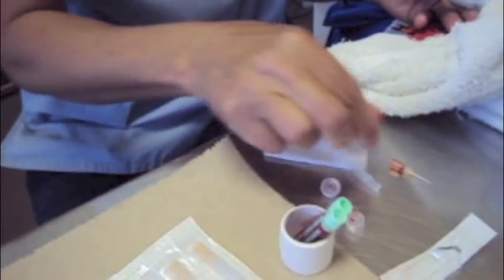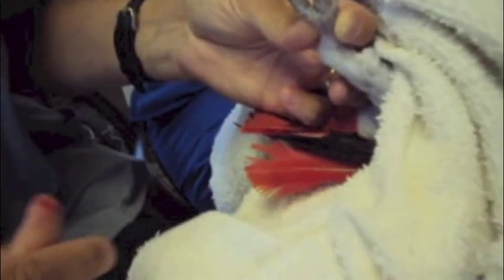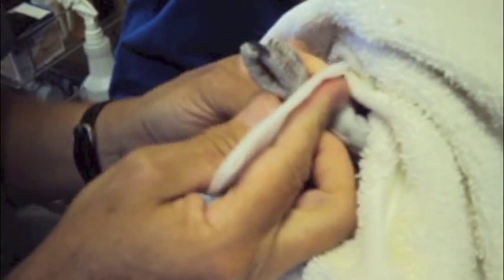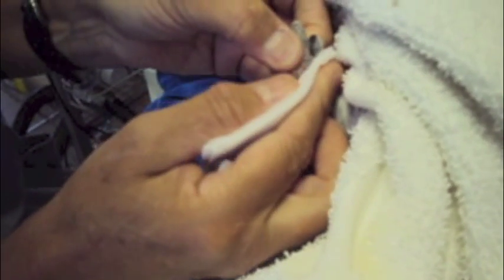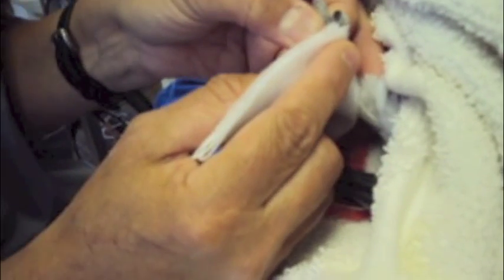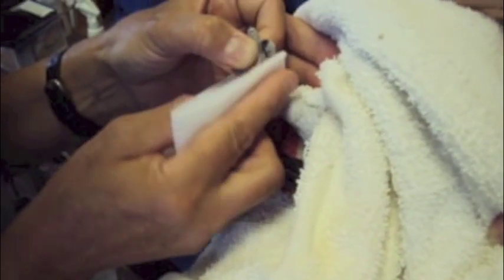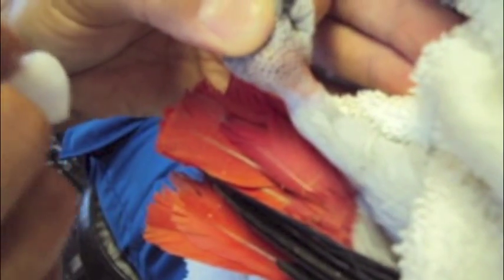During this time I've lowered the bird's head and elevated the foot to help the coagulation process and reduce the pressure in the foot. It takes about 30 seconds for the blood to be taken and another 30 seconds for it to coagulate afterwards, so it's not a very long procedure and it gives us so much information. I like to use a white gauze to check for bleeding — when my gauze stays white, I know it's fine. You can see where I took the blood test; you can barely see it right there on the foot.